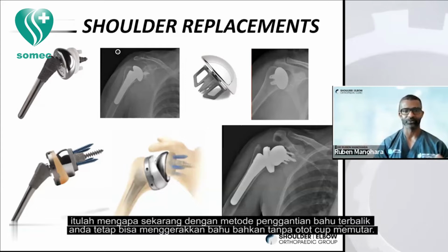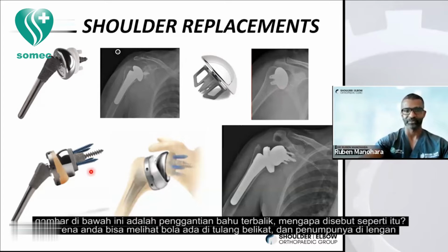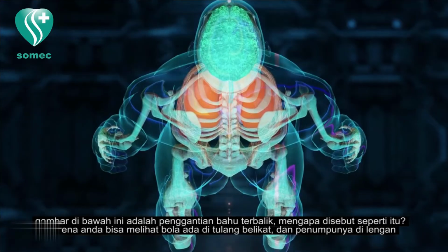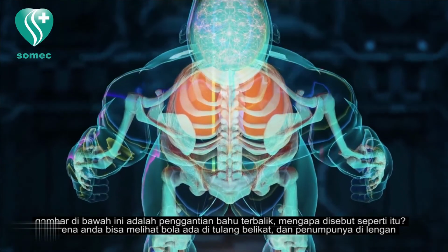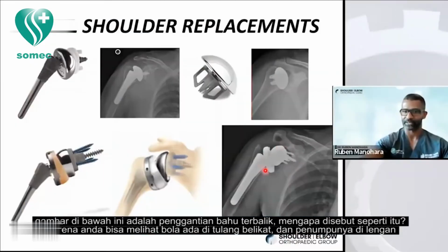That's why now, with the reverse shoulder replacement, it can work even without your rotator cuff muscles. So this bottom row is the reverse shoulder. Why is it called the reverse shoulder? Because you can see the ball and the socket are now the other way around. Now the ball is on the shoulder blade and the socket is on the arm.